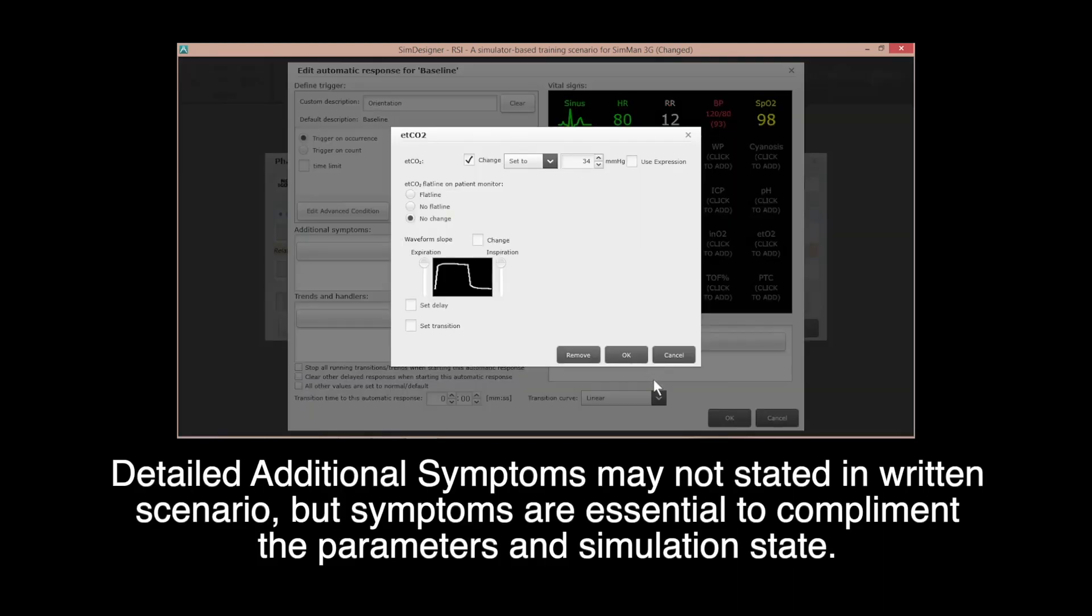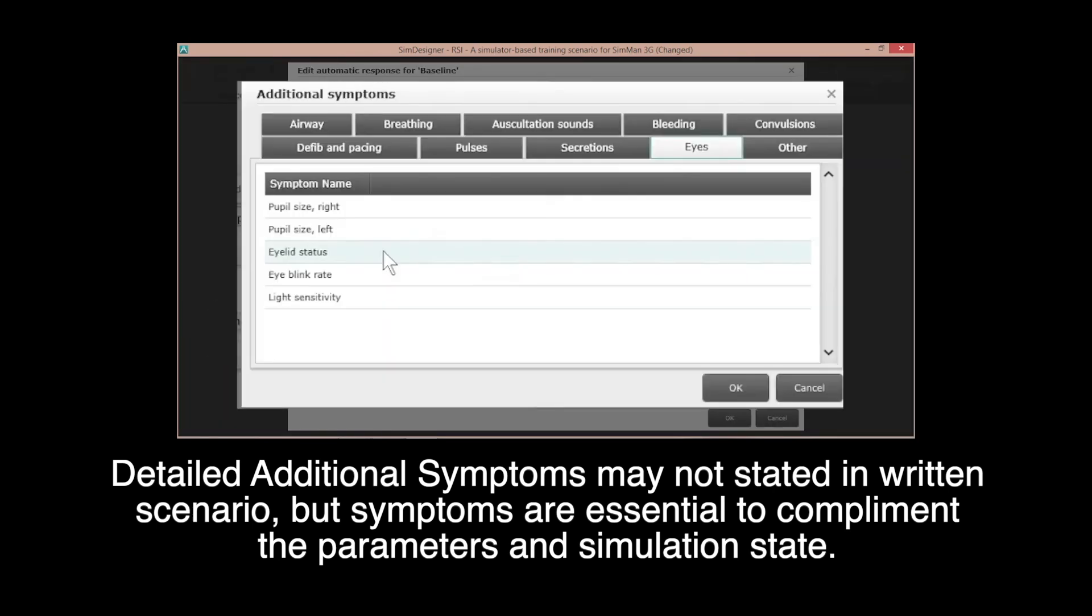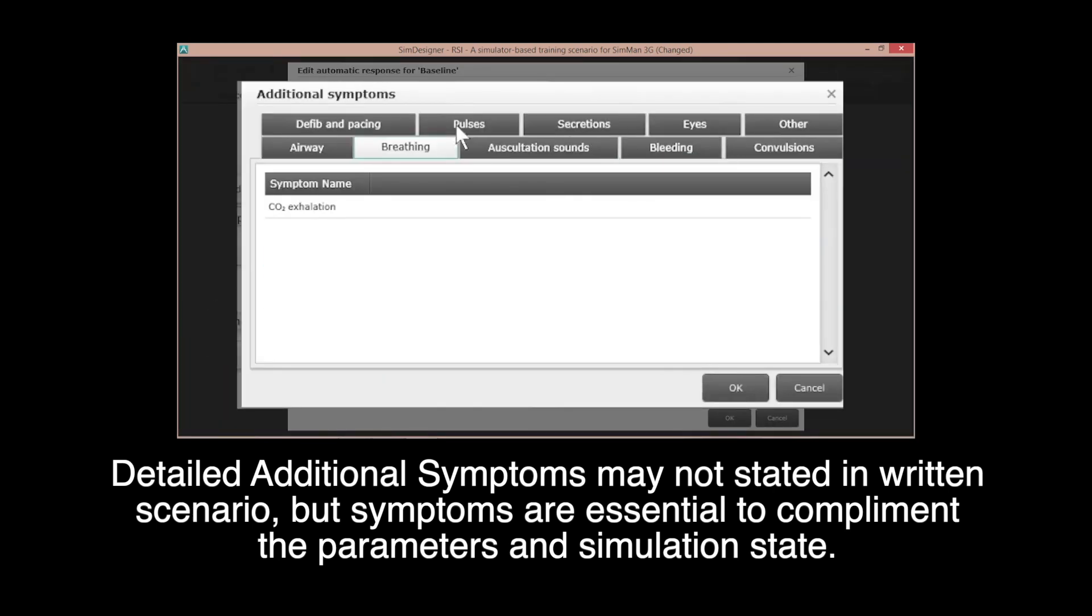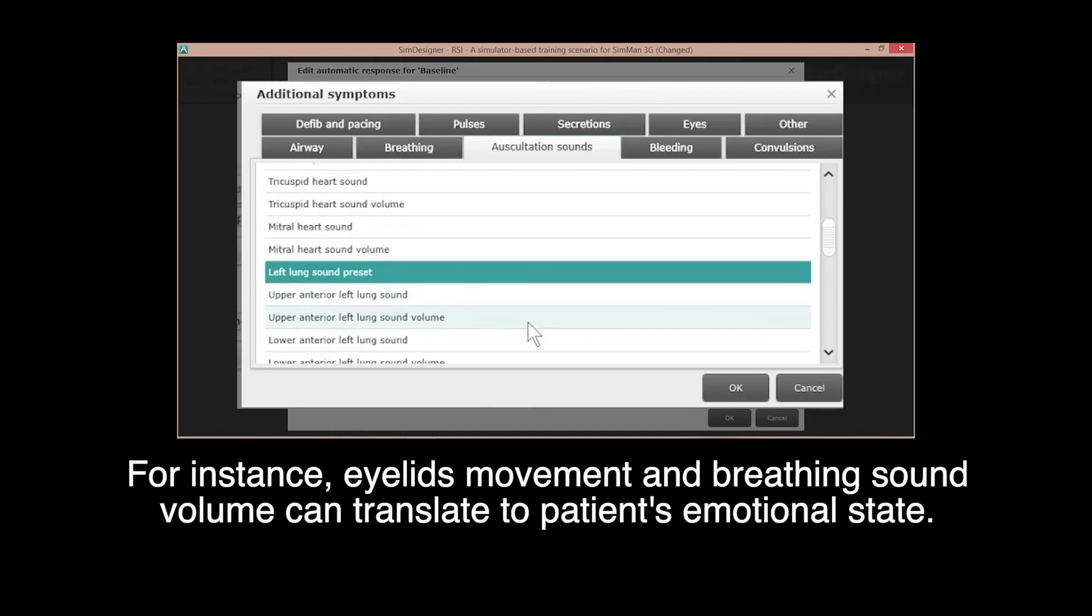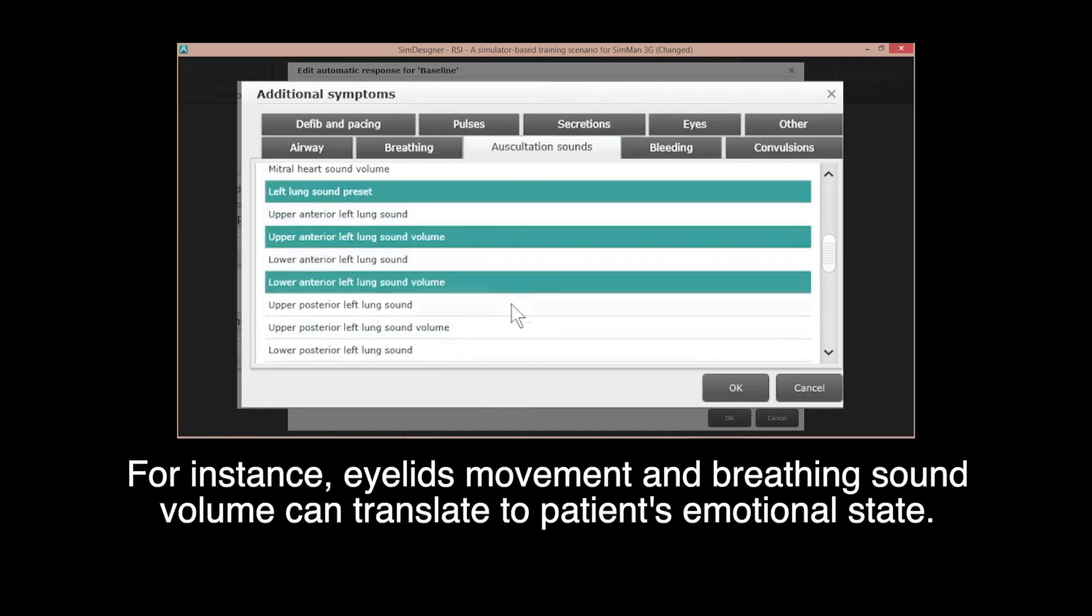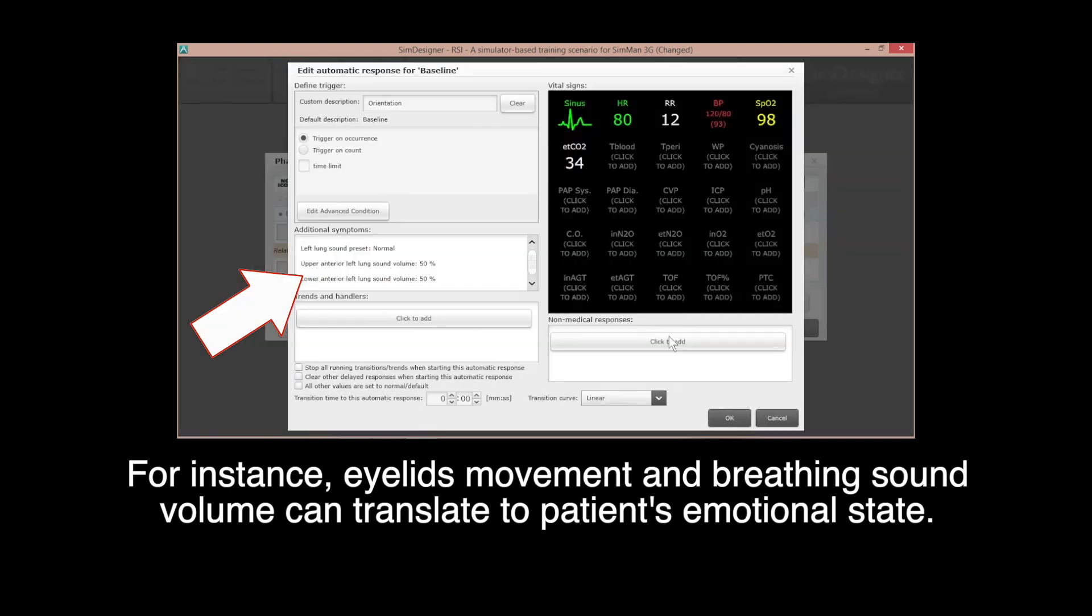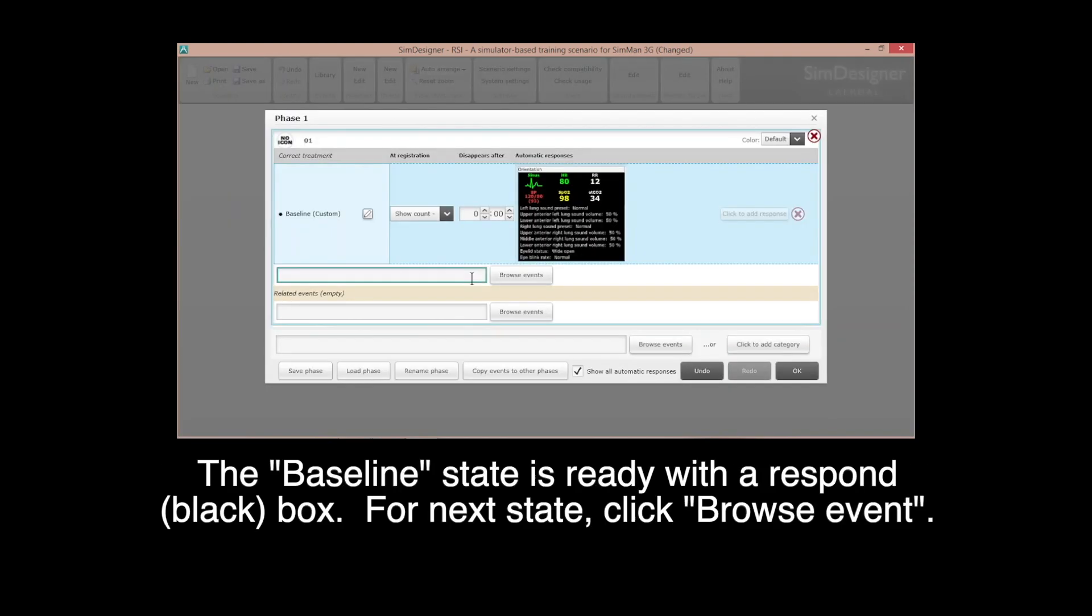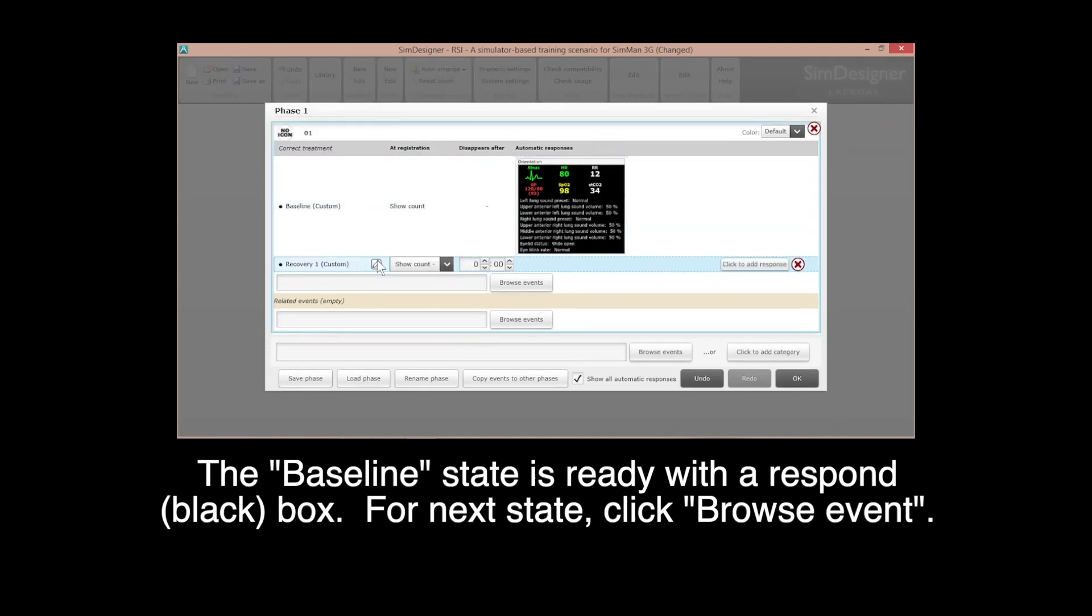Detailed additional symptoms may not be stated in written scenario, but symptoms are essential to complement the parameters and simulation state. For instance, eyelid movement and breathing sounds volume can translate to patient's emotional state. The baseline state is ready with a response box.